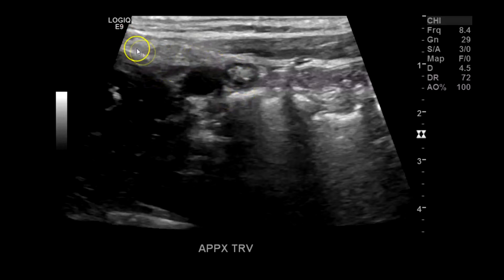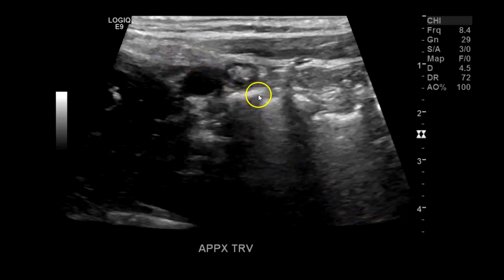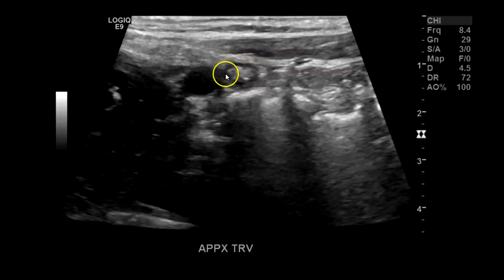Something to keep in mind is that the ureter also passes this plane and can be confused with the appendix, so keep that in mind, especially if there's urothelial thickening, which is edema and thickening of the epithelial lining of the ureter. It won't be blind ending — it'll keep going down into the bladder — and it won't have gut signature, so you won't see all the mucosal layers of the bowel, which the appendix has.